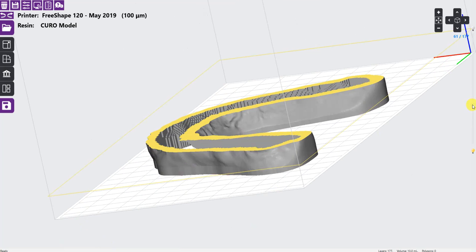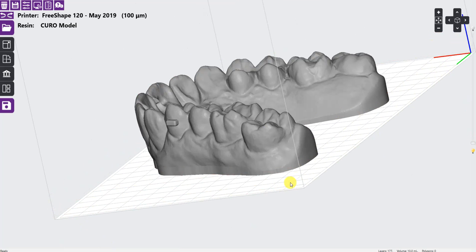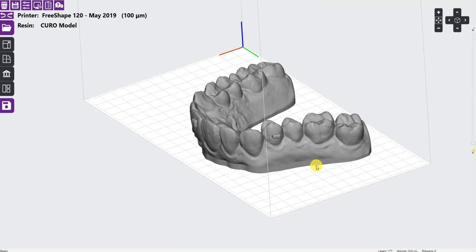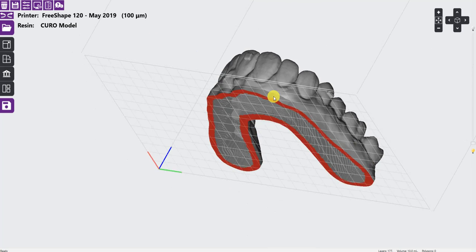For the second print, we printed the model directly on the platform without any supports or weep holes.